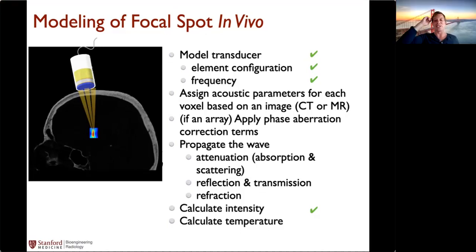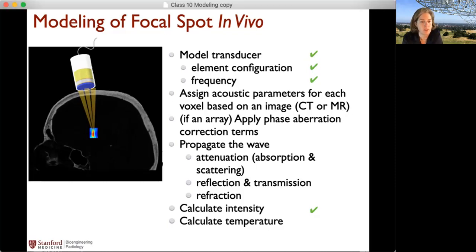Oh, okay. Sorry. Now I'm seeing that there's correction. So what you mean is that for a single element transducer, there will be aberration that we cannot correct for. That's right. Absolutely right. So having the different points there and simulating the different points allows you to figure out what the aberration is. It's something that you won't be able to correct.